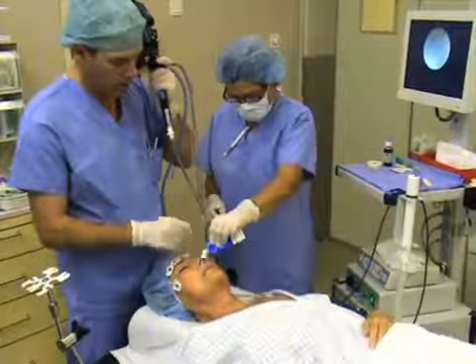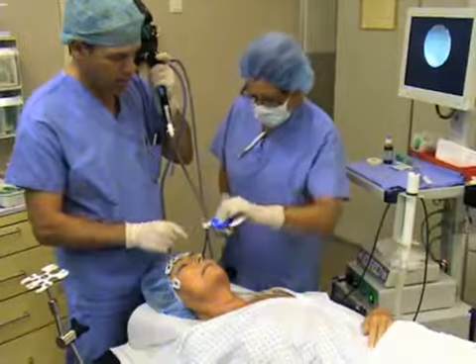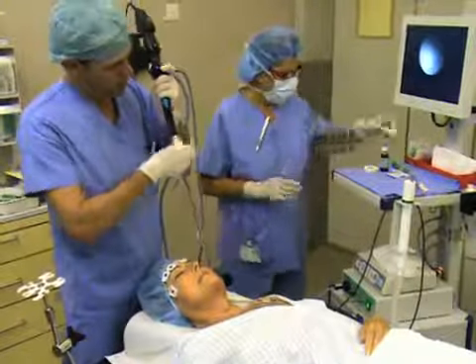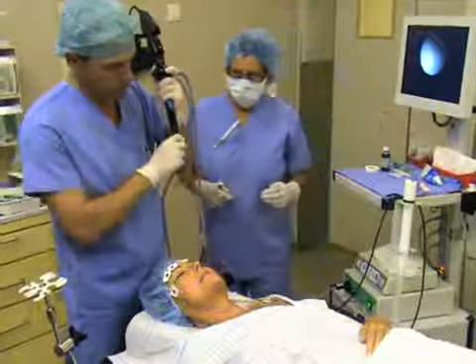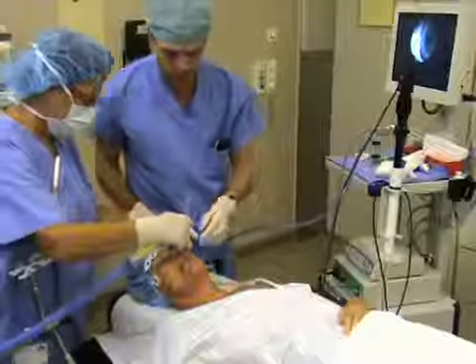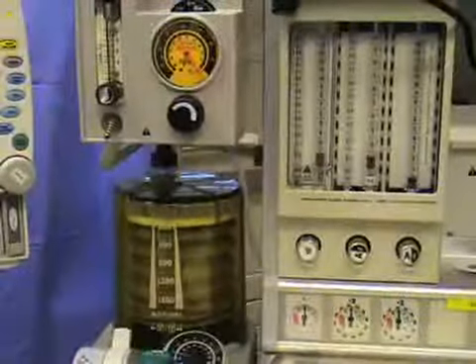Place lubricant at the nasal orifice and on the cuff of the tube. Advance the tube using rotating movements. You may sense a slight resistance at the beginning of the nasal passage. Watch for the appearance of the tube on the screen of the fiberoptic unit and place the tip of the tube 3 to 4 centimeters above the carina. Remove the fibroscope and attach the tube to the ventilation system of your anesthesia machine.